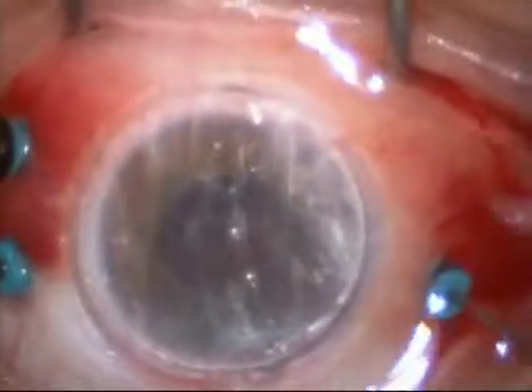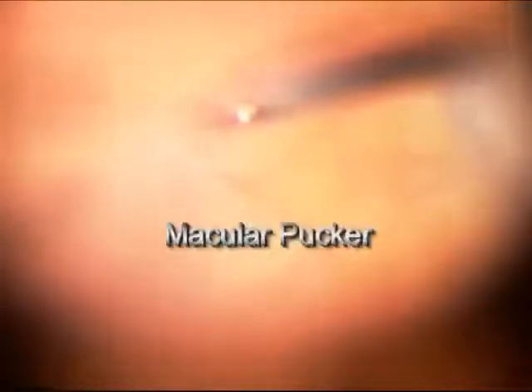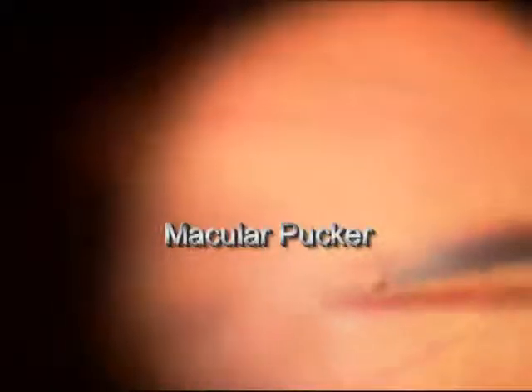In order to remove the macular pucker, a high-resolution contact lens is placed on the eye. What you're seeing is a forcep on the right side of the screen which is used to peel the pucker gently from the retina. The pucker is a very thin layer of transparent tissue, not unlike scotch tape — it's very hard to see as it's removed from the eye. If you look toward the middle of the screen, you'll see the edges of the pucker being pulled from around the forceps as the forceps are maneuvered inside of the eye.